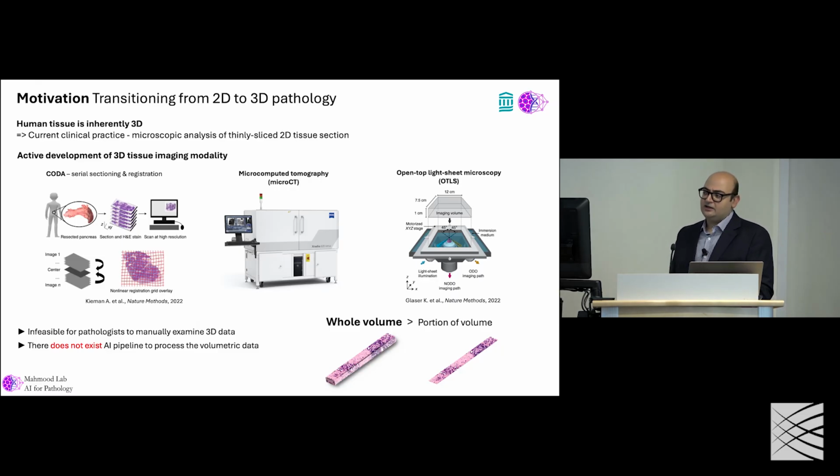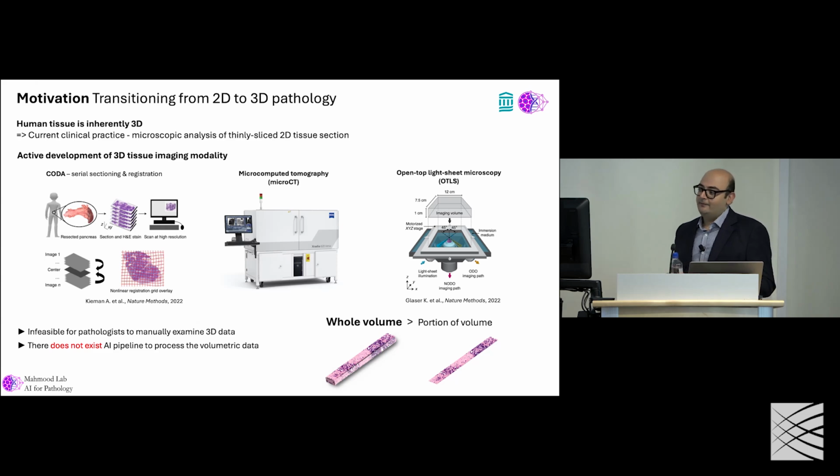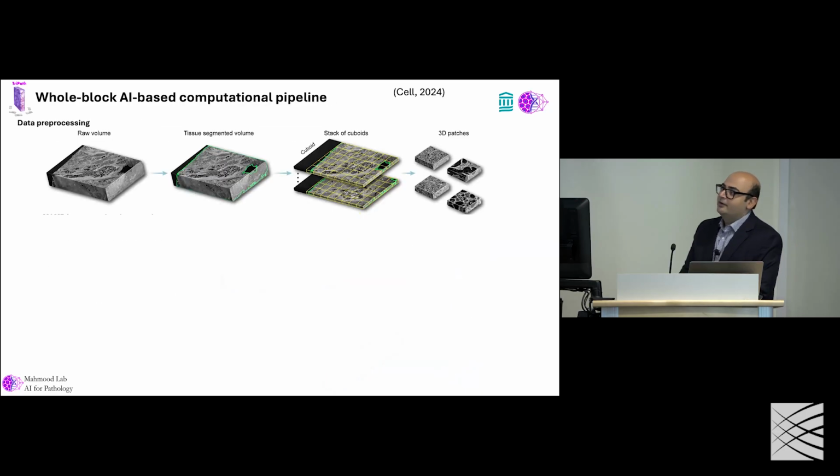The other aspect is that if we are able to image this tissue in 3D, and pathologists are looking at this using just their eyes, it will be impossible to cater to the patient workload. It's also difficult to make discoveries from this data. For discovery, we're effectively interested in finding common morphologic features across large numbers of patients that correlate with either response or resistance to treatment, or just to separate them into distinct risk groups, which is also difficult to do manually.